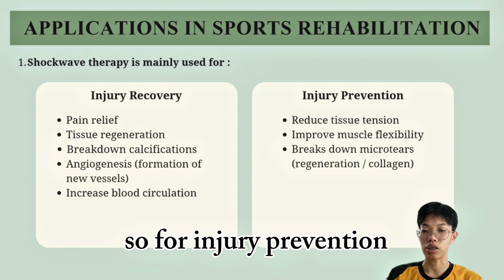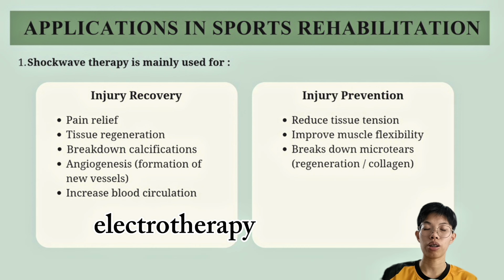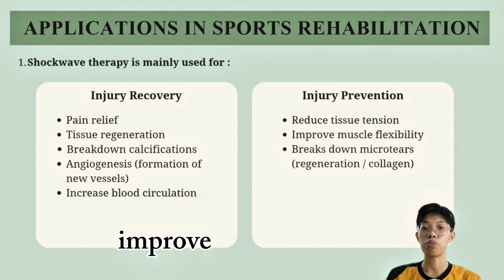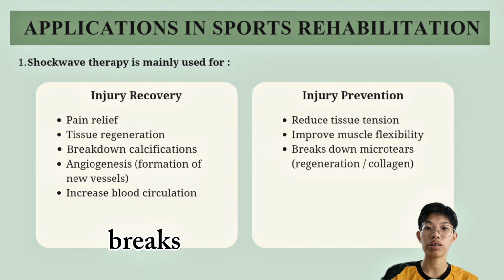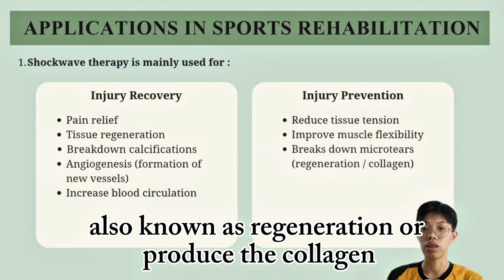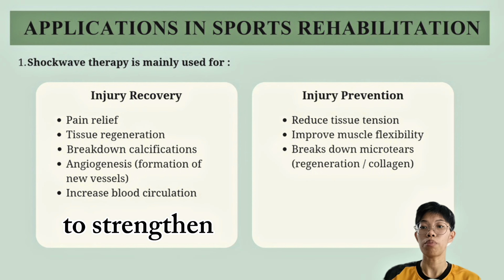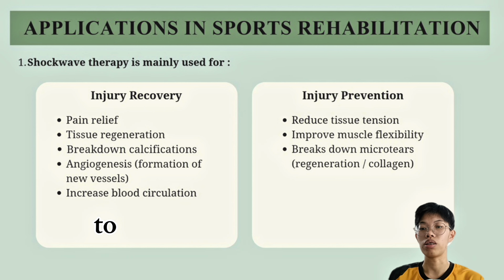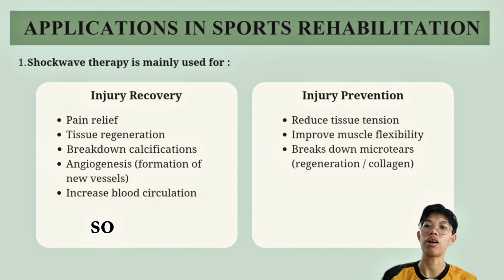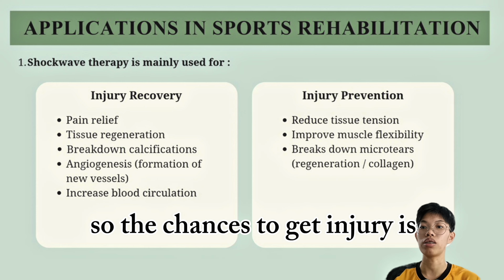For injury prevention, shockwave therapy can be used to reduce tissue tension, improve muscle flexibility, break down micro tears, also known as regeneration, or produce collagen. This is to strengthen the muscle, reduce the tension and tightness of the muscle, so the chance of getting injured is reduced.